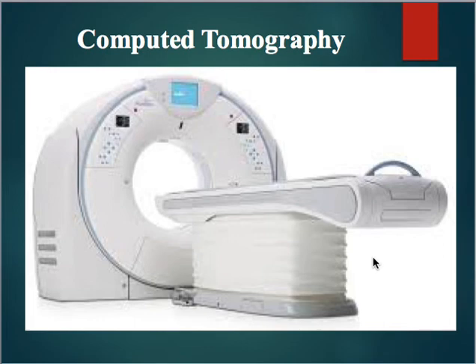Some people also refer to CT as a CAT scan. CAT stands for Computed Axial Tomography, because we use computers. Axial is the plane we slice in, and again, tomography is imaging by sections, or seeing a slice. Axial is the most common scan plane used in CT. CT can scan in axial, sagittal, and coronal planes, but axial is the most common plane used in CT.